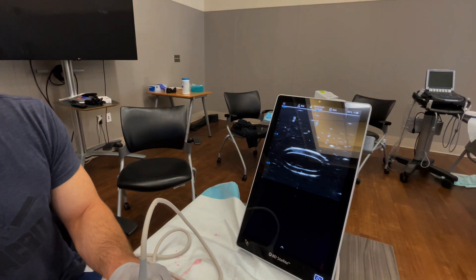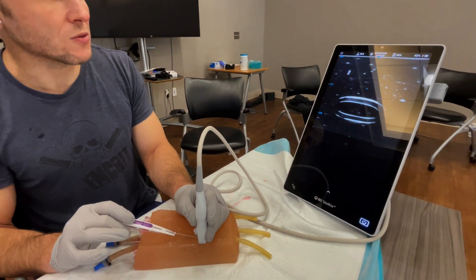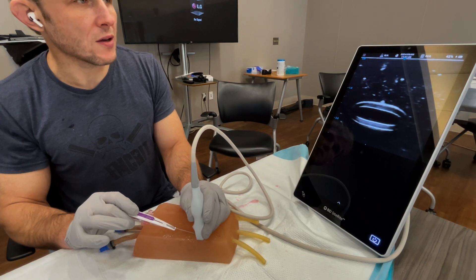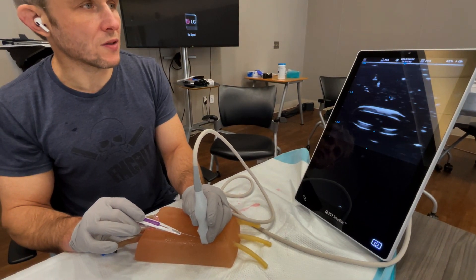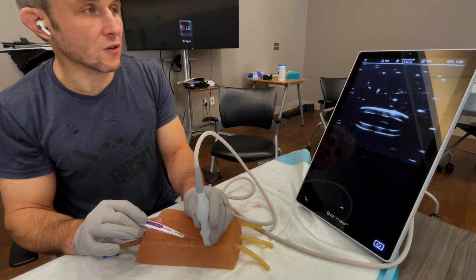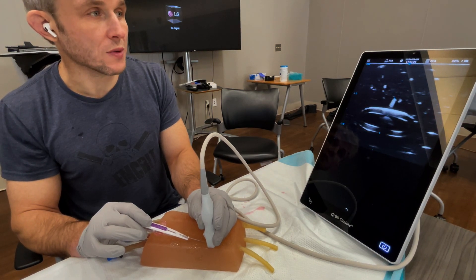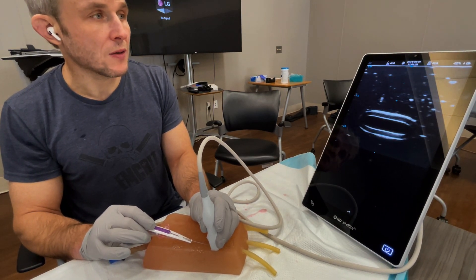One key is to make sure you're tracking your needle tip and not the shaft. What I do is move my ultrasound up the arm until I can no longer see the needle tip — meaning the tip has gone past. Then I move my needle forward again until I can see it, then move the ultrasound so it disappears again. I keep doing this back-and-forth motion, inch by inch. I find that if you try to keep the tip in view the whole time, you tend to drift onto the shaft. By moving the ultrasound until the tip disappears, I can be certain that every time it appears, it is actually the tip.